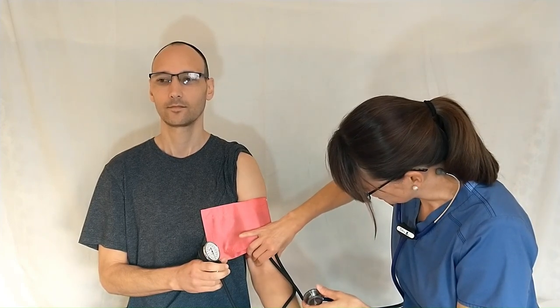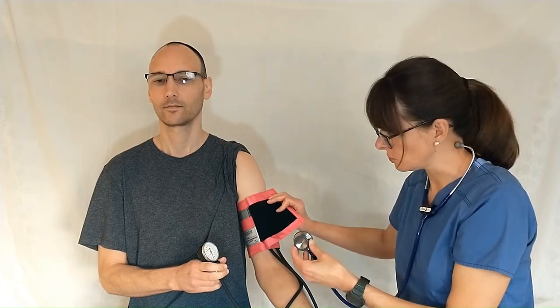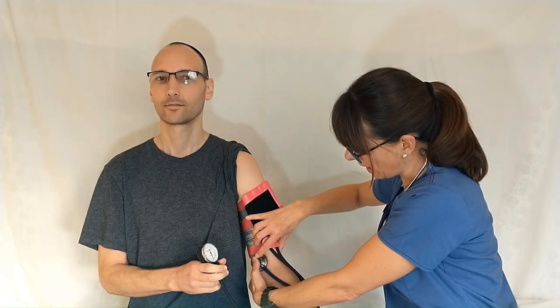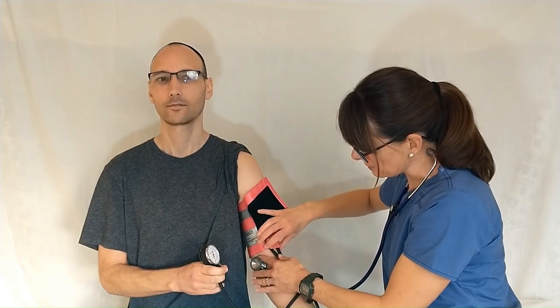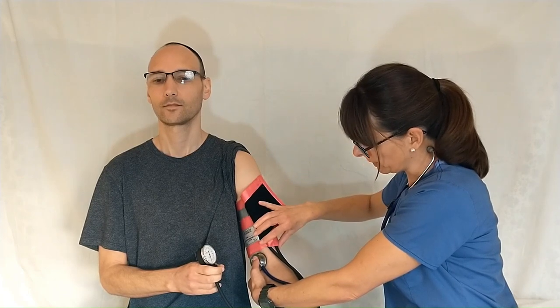I'll bring the tubing around and then place my stethoscope at the patient's brachial artery — right where I just palpated — and put my stethoscope there. Make sure you're not jamming it underneath because that might cause friction that you can hear, which is very distracting especially when you're just starting. The best way to hold it is to secure it with the thumb of your non-dominant hand and have the fingers of the same hand behind the patient's arm. That way you can squeeze it against the arm and it'll be pretty steady. Other techniques use the index and middle finger, but that makes it a little too wobbly.